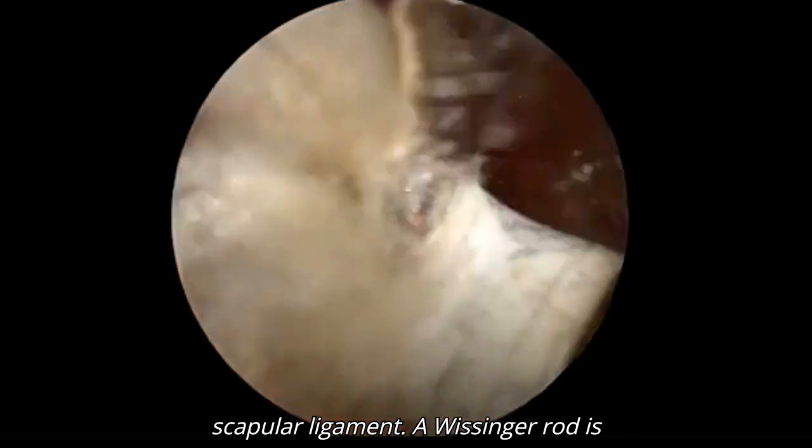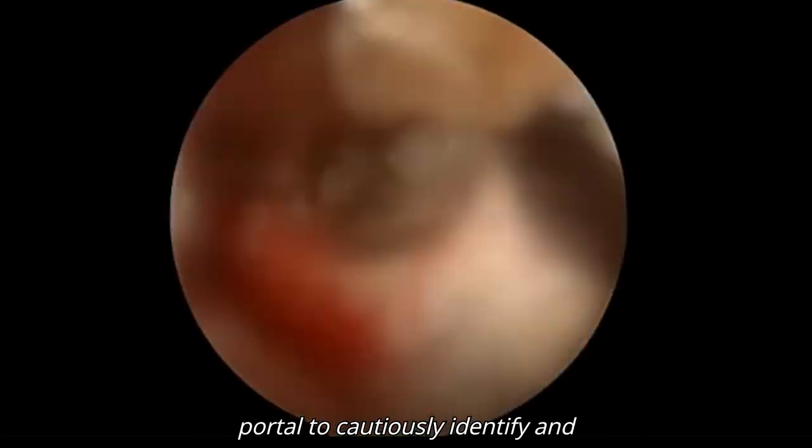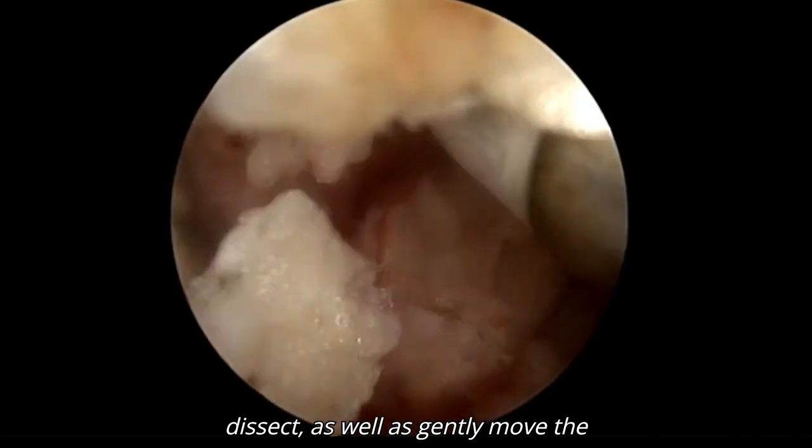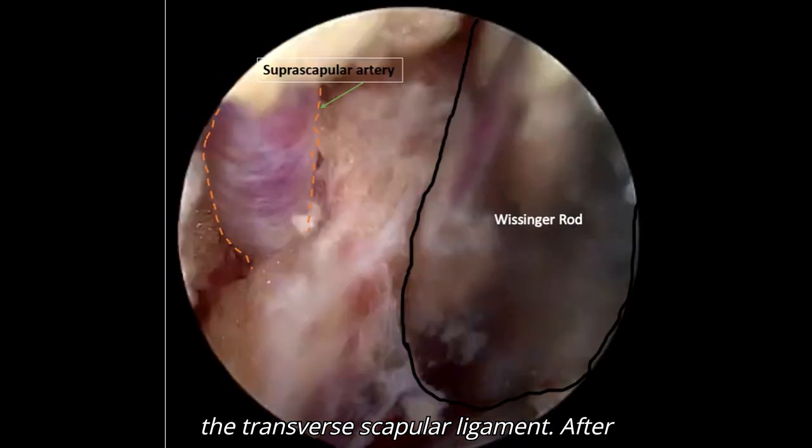A Wissinger rod is inserted through an accessory Neviaser portal to cautiously identify and dissect, as well as gently move the suprascapular artery lying superior to the transverse scapular ligament.